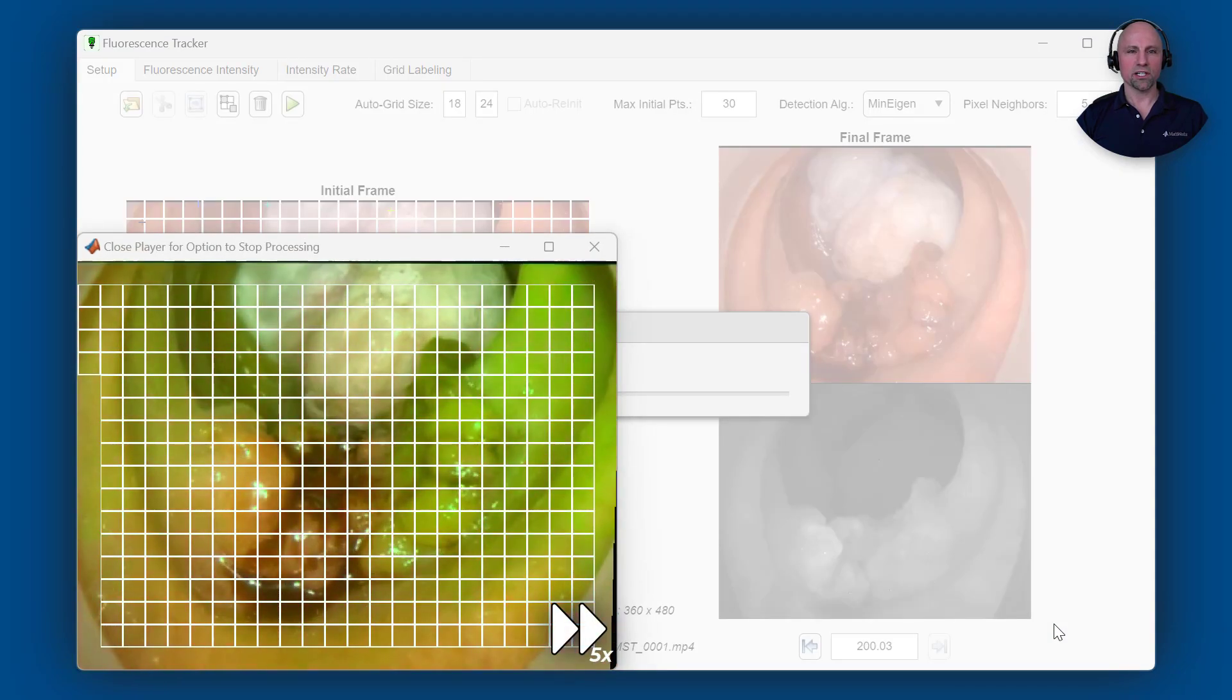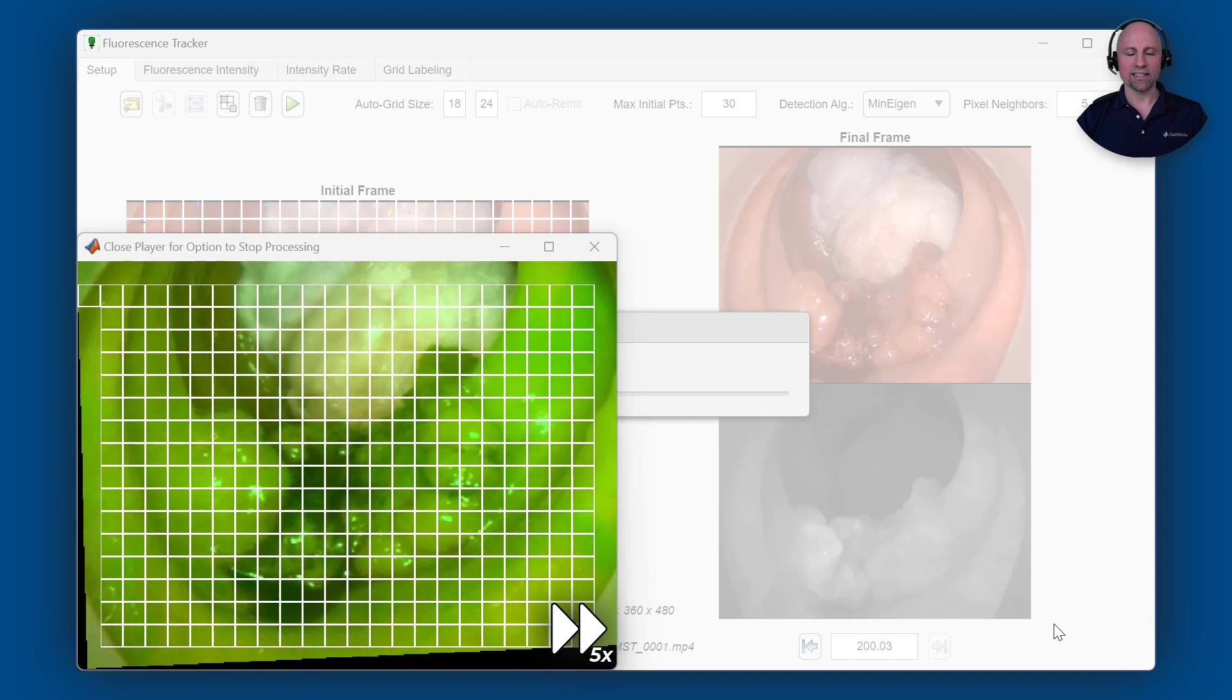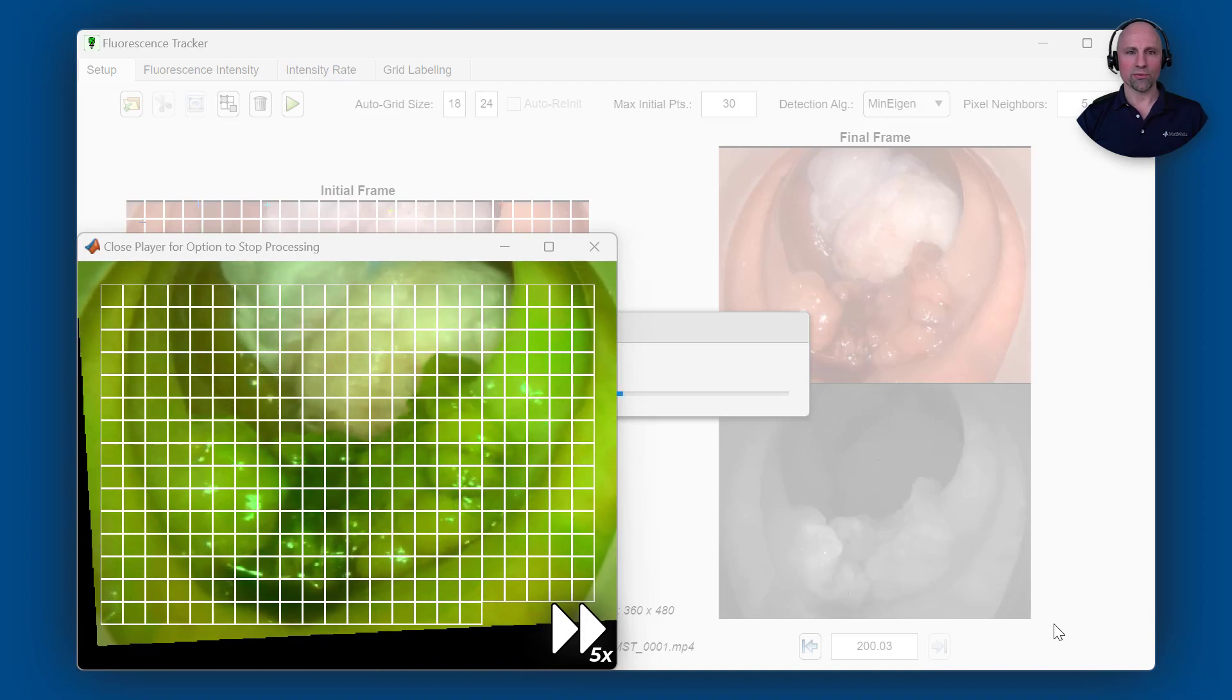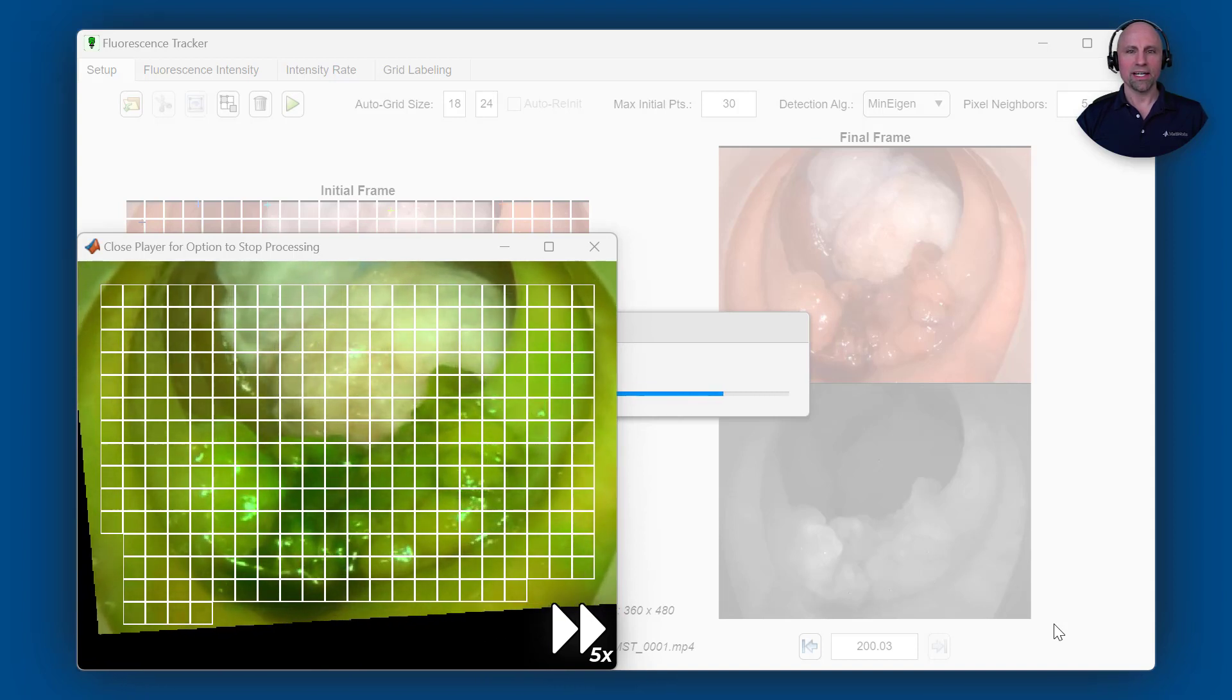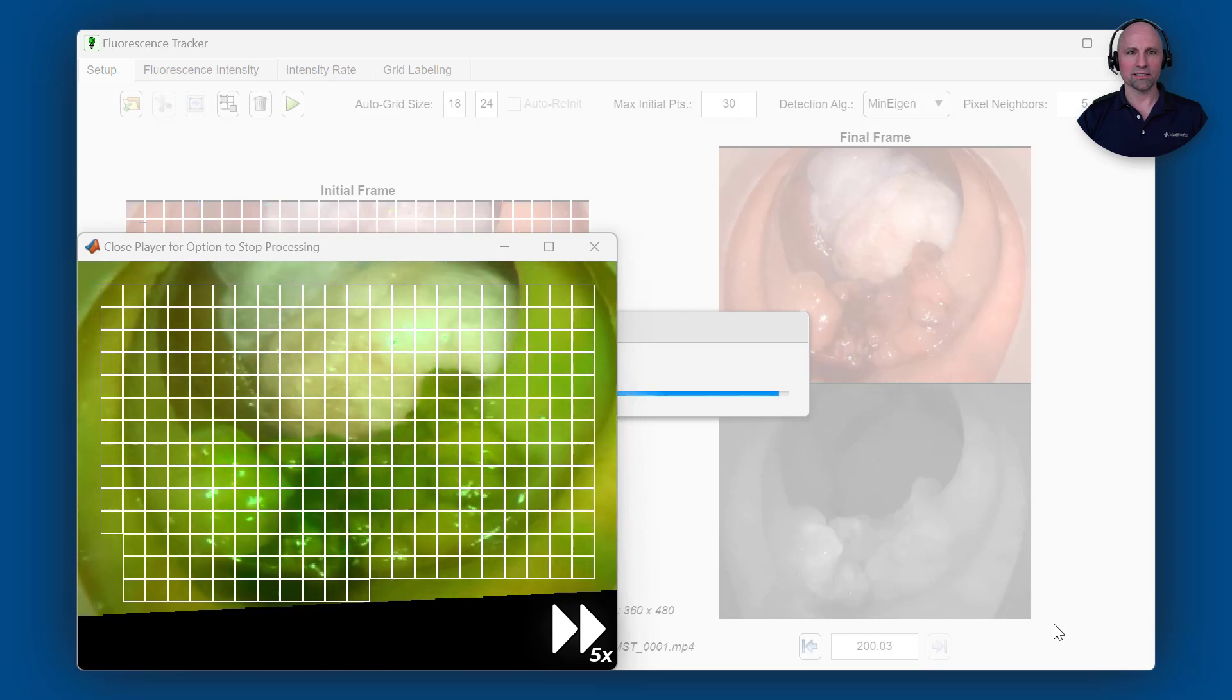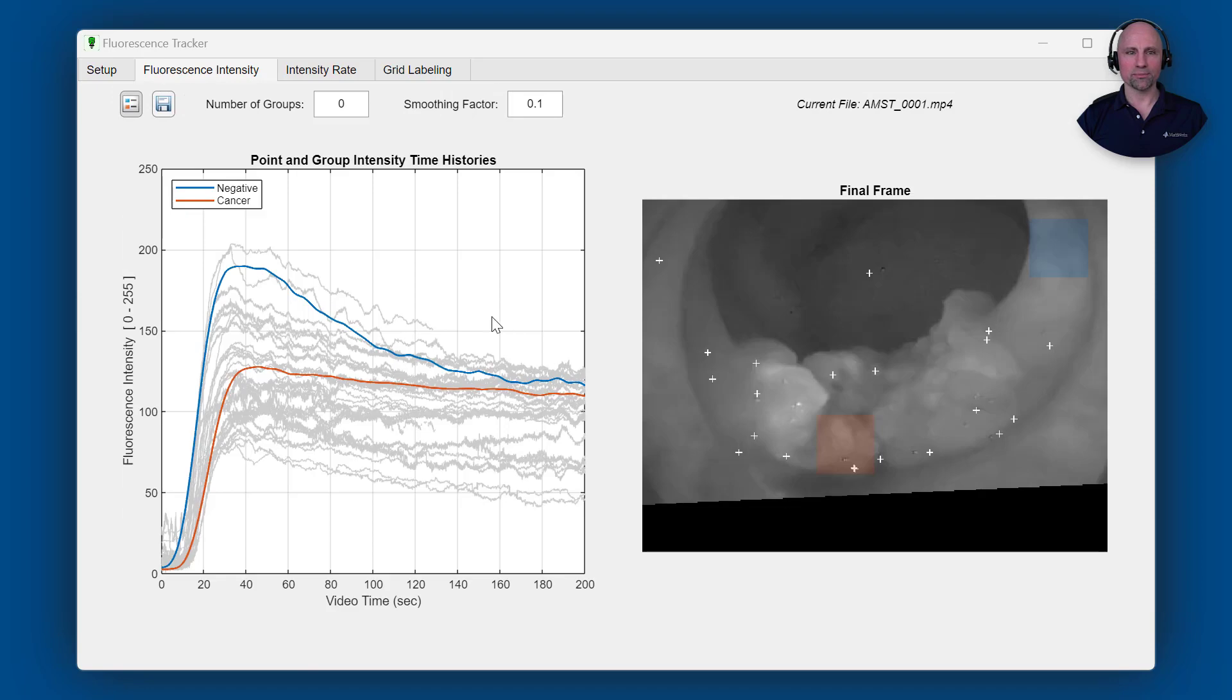As seen in this false color overlay, when used with an injection of indocyanine green fluorescent dye into the bloodstream, this system offers an effective way for clinicians to visualize blood perfusion as the dye becomes fluorescent when excited by near-infrared light. A team at the University College Dublin Center for Precision Surgery is researching if changes in the fluorescence intensity that result from variations in the dye absorption can be used to discriminate normal tissue from cancerous tissue.